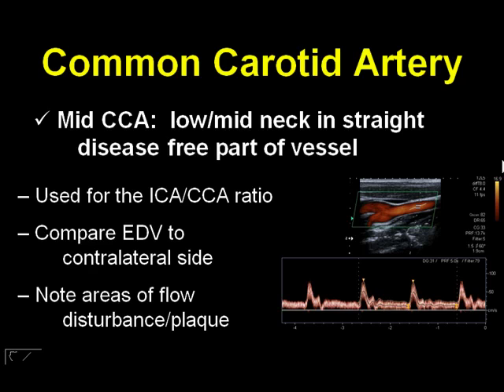Another reminder is that we should be evaluating the whole length of the carotid artery system using all the tools in your toolbox, and we always use color. In the old days, before we had color, we had to take that sample volume and step it through and move that sample volume up and down and back and forth within the carotid artery system. However, one of the advantages of color flow imaging is that it allows you to see a wide field of view.